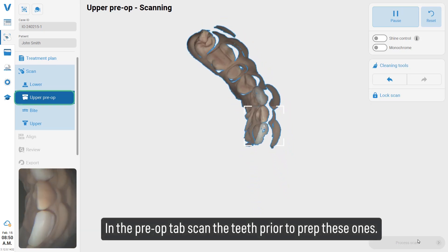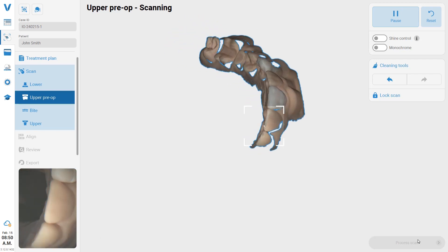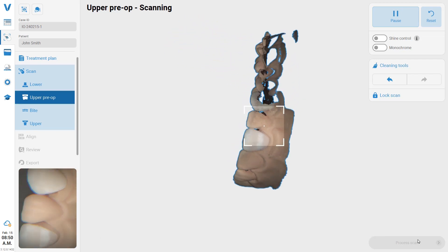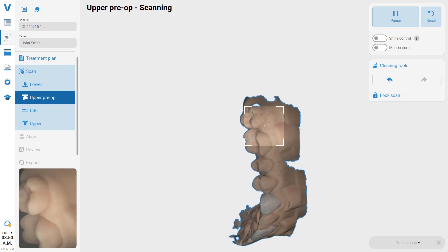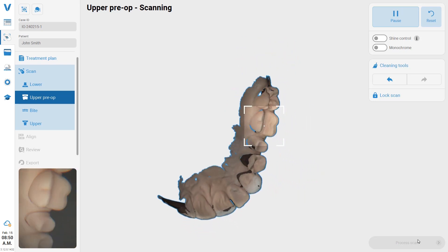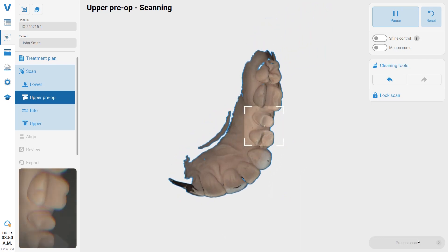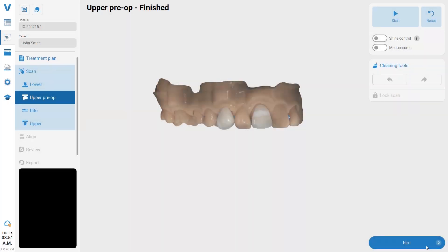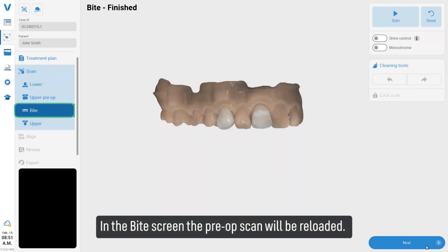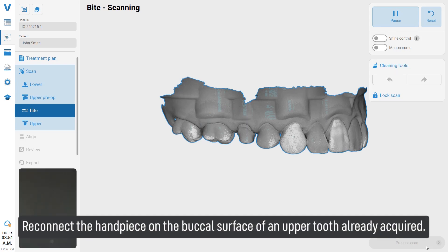In the pre-op tab, scan the teeth prior to preparation. In the bite screen, the pre-op scan will be reloaded. Reconnect the handpiece on the buccal surface of the tooth.